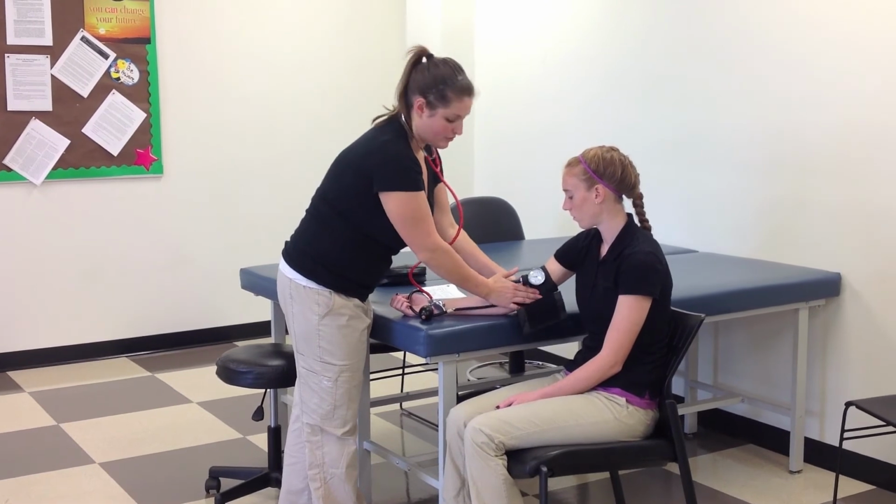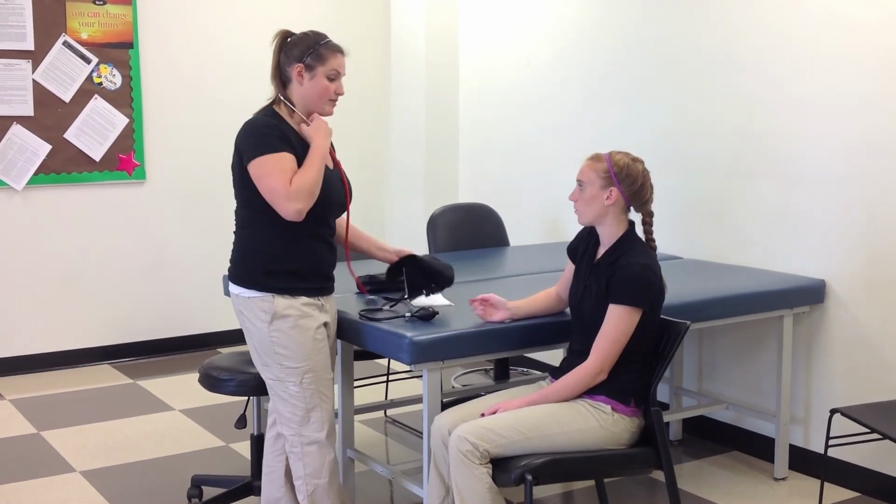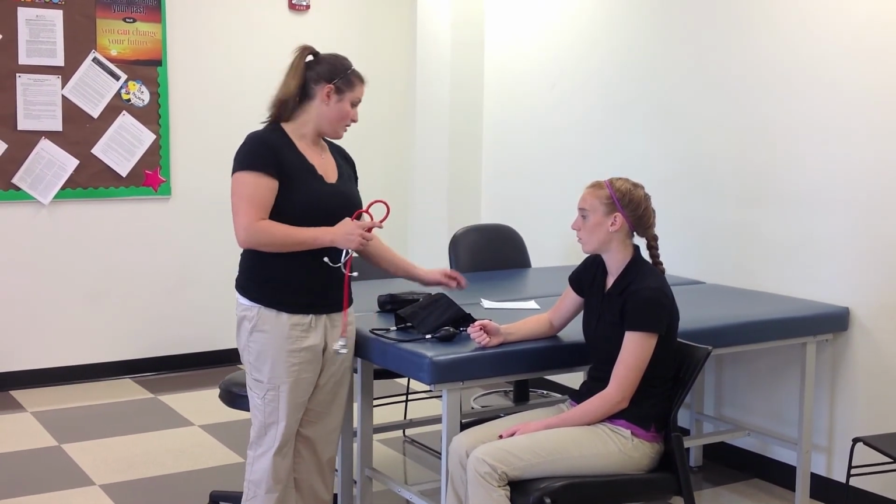Okay, her blood pressure was about 109/72. When I pumped it up and released the pressure, I was listening for the first Korotkoff sound, and that would tell you your upper number, which hers was 109, and that would be the systolic number of your blood pressure, and then you listen until you don't hear the sound anymore, and at that point where the needle is, that's your diastolic number. The average for an adult would be 120 systolic or lower, and 80 or lower for diastolic.